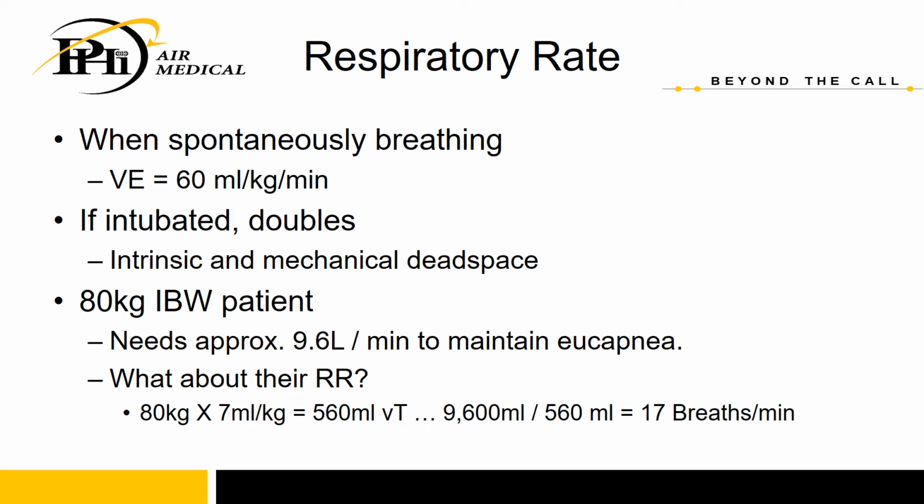Respiratory rate, which is setting number 3. So when we are spontaneously breathing, we need to be moving quite a bit of air in and out of our body every minute in order to maintain eucapnia, specifically 60 milliliters per kilogram per minute of our ideal body weight.